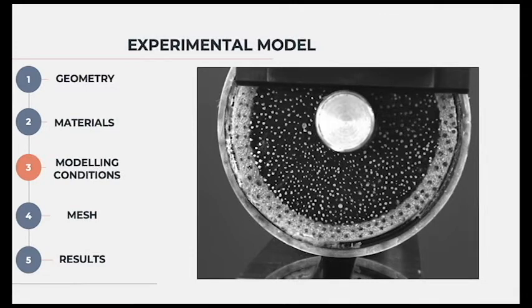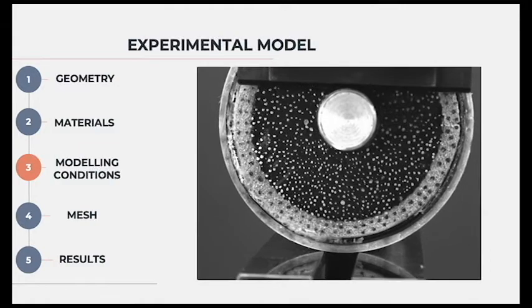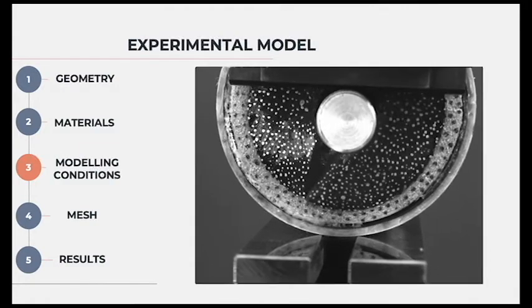Dots were randomly distributed across one face of the model, such that the model's strain could be accurately captured by digital image correlation. All of the results taken from these models were taken as a stress in the direction of loading at the outer surface of the stump. Thus are insightful to understanding whether the limb is likely to undergo any skin degradation or pressure ulcer formation, which would cause significant discomfort to the amputee.